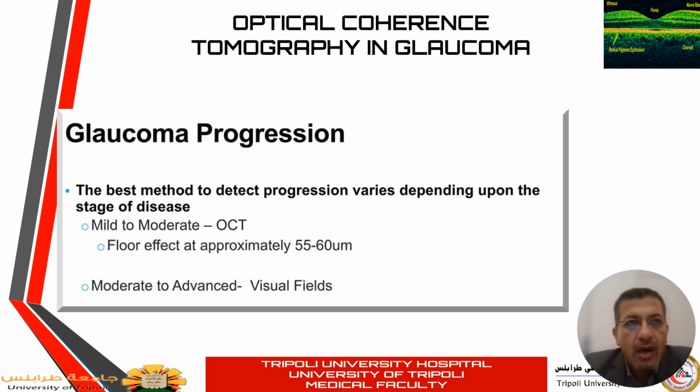In general, we have to establish a good progression analysis program for your patient. At least 3 visits are needed. One baseline visit is very important, after excluding the artifacts and the false positive and false negative results. And then you follow your patients to determine whether your patient is stable or not. Now we will come and see how to establish this progression analysis program.